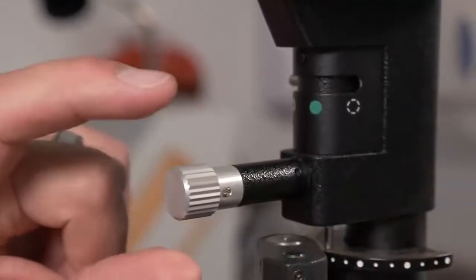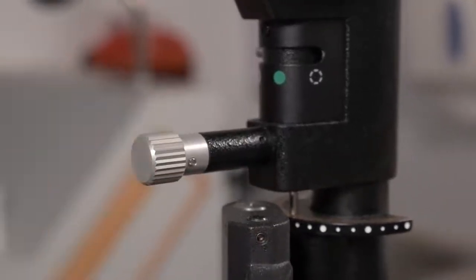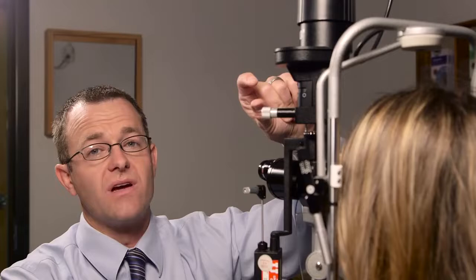So let's say that you're measuring the size of a corneal abrasion, or more importantly for me as a retina specialist, if you're looking at the size of a hyphema, which is blood buildup in the anterior chamber, you can actually measure how tall it is, and then record that so that later on you can note, oh, it was a 5 millimeter hyphema this week, and then a week later it went down to 3 millimeters. Obviously having less hyphema is better than more, so you can track that. That's especially important with corneal ulcers or corneal abrasions. But in the retina world, we use it especially to measure the size of hyphemas, or blood in the anterior chamber.